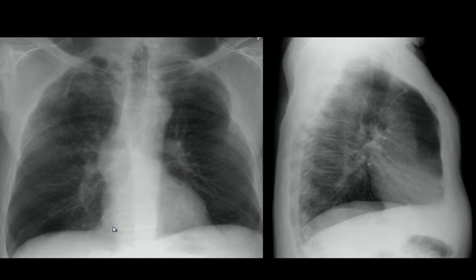I have a question, Dr. Chadha. Yes. As far as NSIP, they have a similar look as well. This is NSIP pattern. Yes, this is NSIP pattern. COP is an NSIP pattern. All right, John.